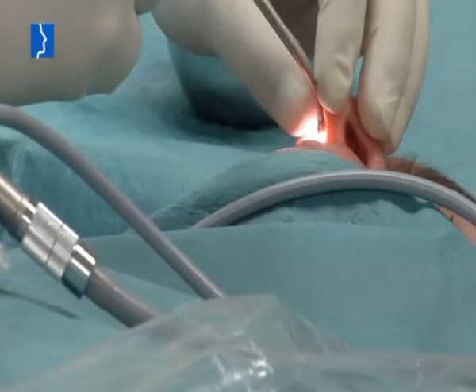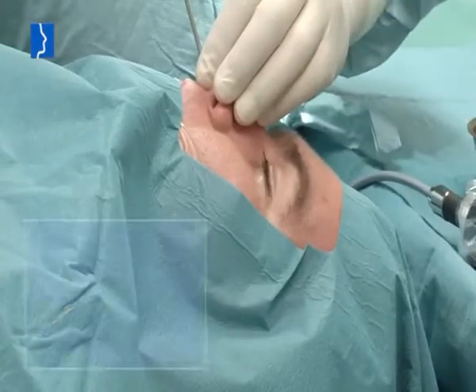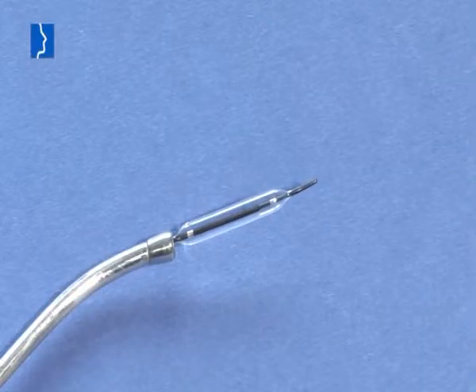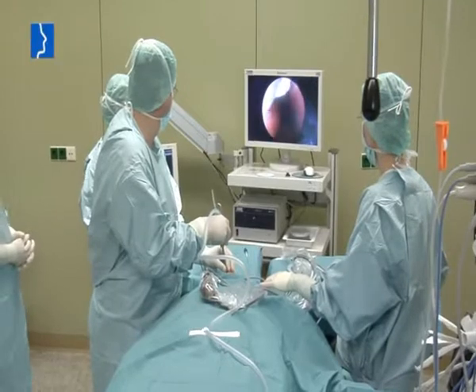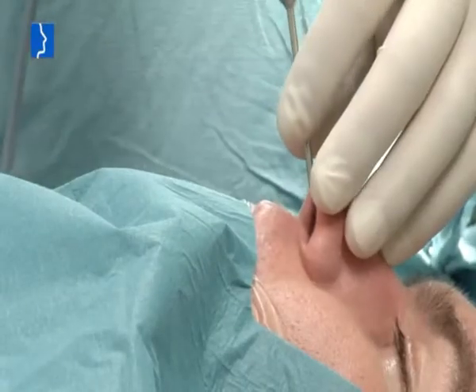Micro and endoscopic operating methods are nowadays state-of-the-art in medicine. With the development of balloon catheters for coronary artery dilation, new treatment methods have evolved that are now, for the first time, being used to treat eustachian tube dysfunctions. We are now, for the first time, initiating causal treatment for this chronic functional ear disorder, which means releasing blockages in the eustachian tube by means of an inflatable balloon.